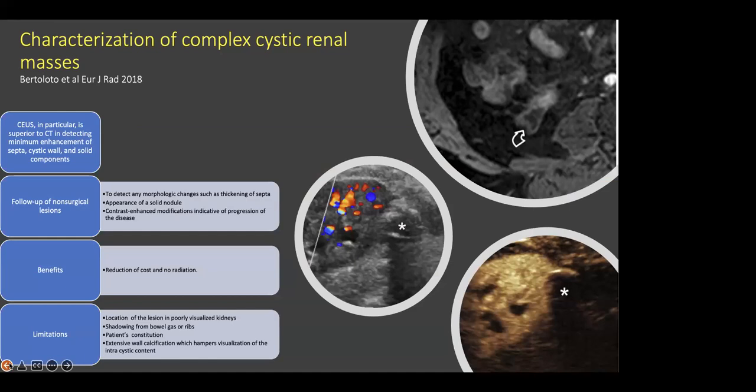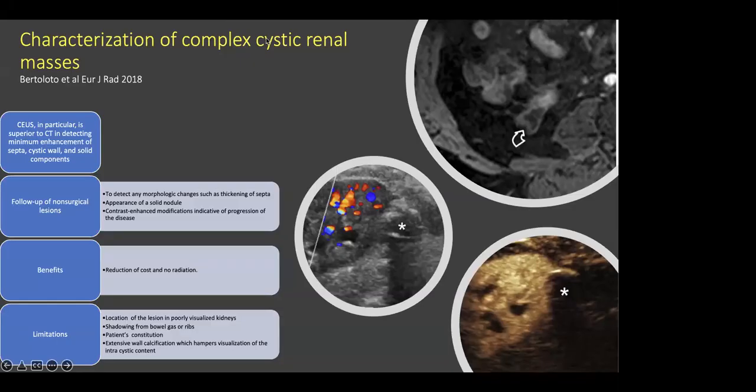So one has to be very experienced and should have very stable hands to do the ultrasound and record simultaneously. It is very important to record the images in a cine mode so that you can see the changes that are happening, because these are all micro bubbles.